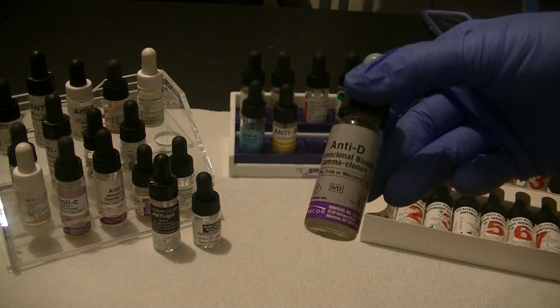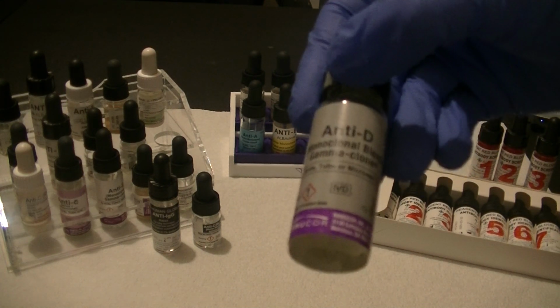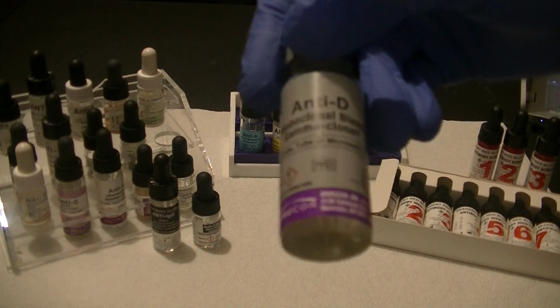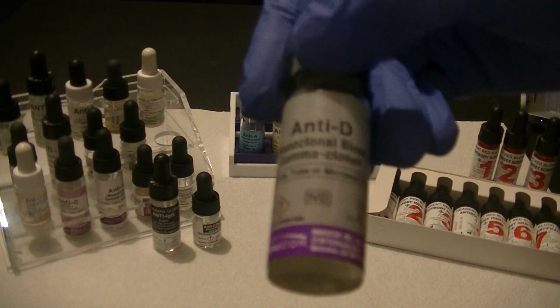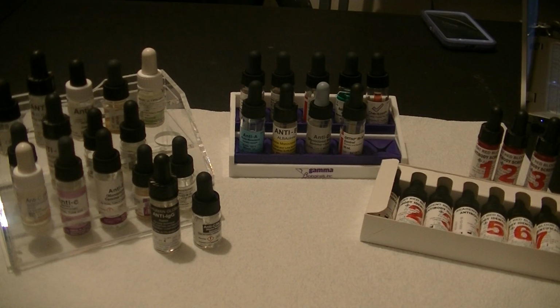You've also previously seen anti-D. Anti-D is how we determine if a person is Rh positive or negative for their blood type. This antibody in a bottle will bind to antigen D on the blood cells. There are, however, up to 300 different antigens that can be present on a person's blood cells. So there may be a situation where we need to know what other antigens are on a person's red blood cells for purposes of transfusing them with someone else's cells.